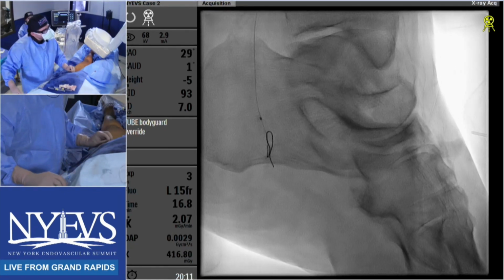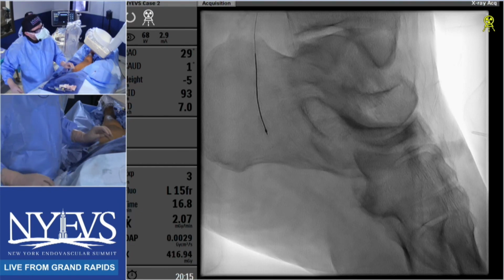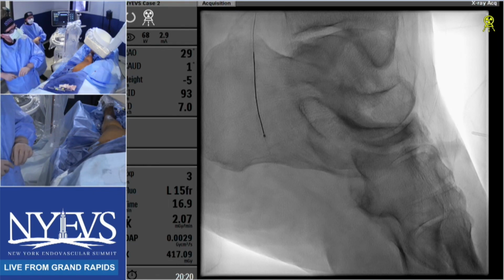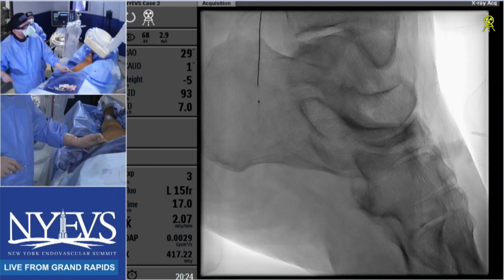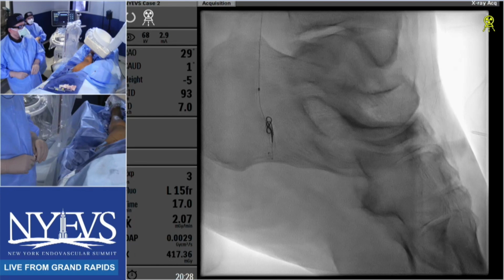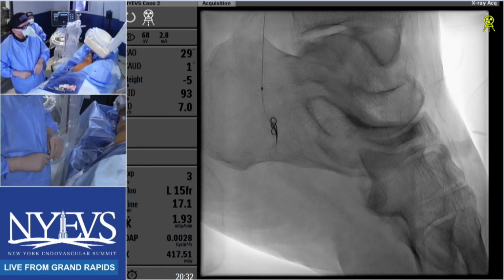No, I think it's the same. It's great technique. The challenge is that this is blind, right? And calcium is usually a nice little marker, and a push and a hope is usually the way it goes. But a push and a hope many times can create a lot of perforations. But in an occluded artery that has no flow.